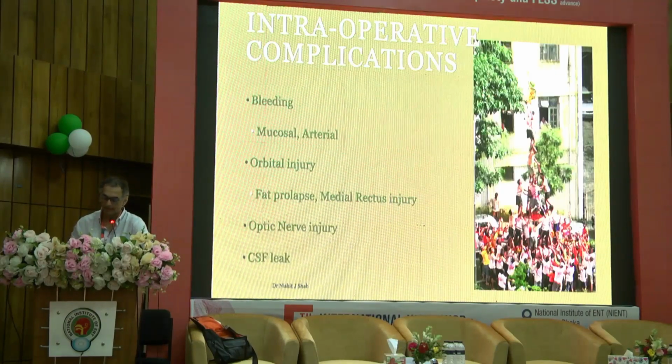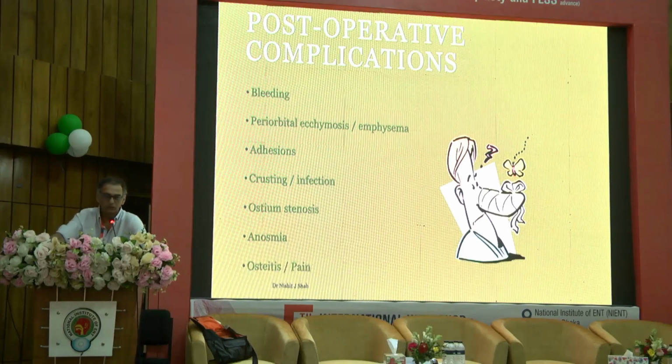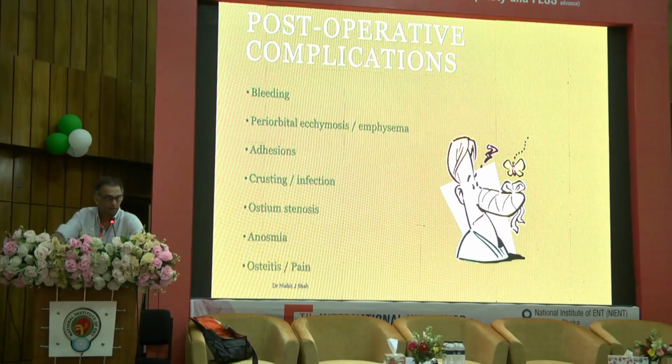And when we look at complications today, we are going to look at the three main issues, which is bleeding, the eye, and CSF leaks, are three main primary concerns. Post-op, of course, there's a whole host of other things that you can get in terms of complications. And though they may not be as serious as intra-op, it can add a lot to the morbidity and the recovery time of the patient.